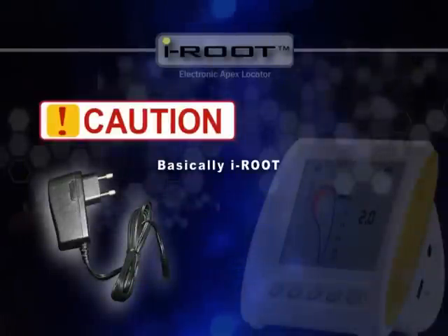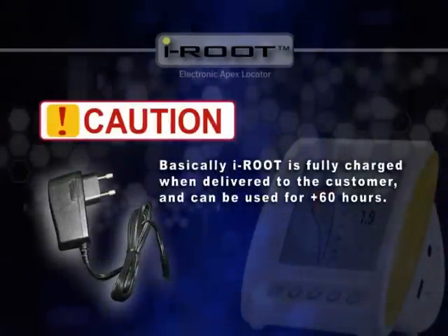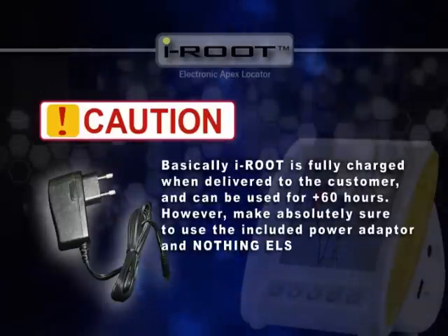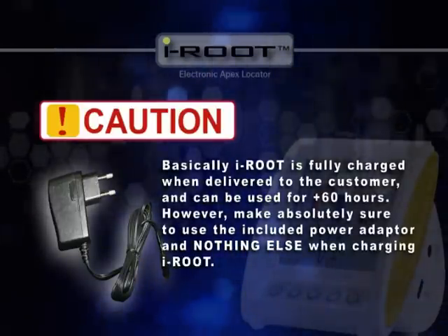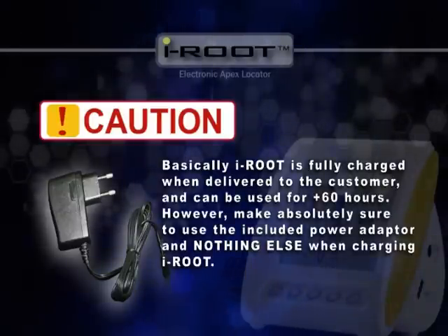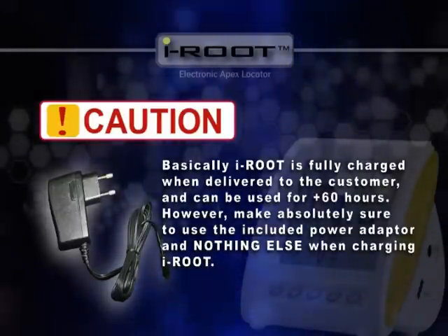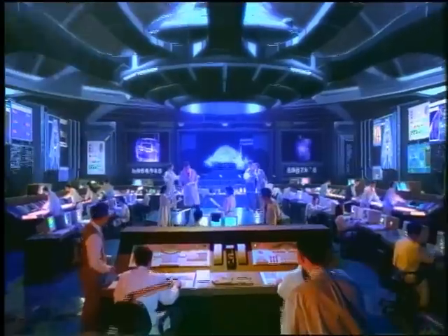Things to keep in mind when using iRoot: one power adapter is included in the package for charging the lithium-ion battery. iRoot is fully charged when delivered to the customer and can be used for over 60 hours. However, make absolutely sure to use the included power adapter and nothing else when charging iRoot.